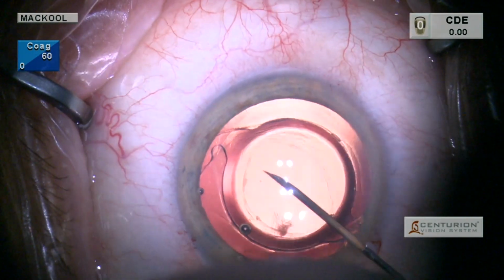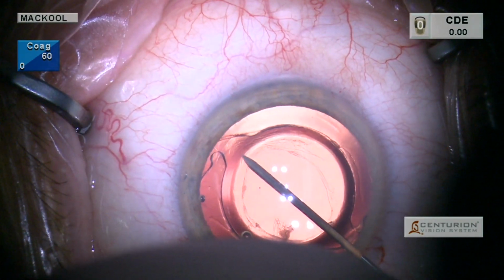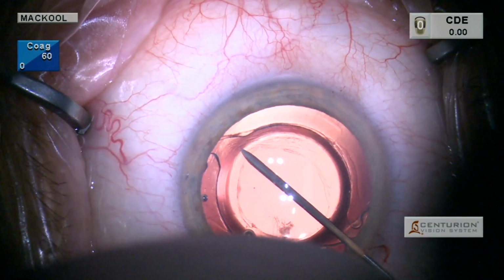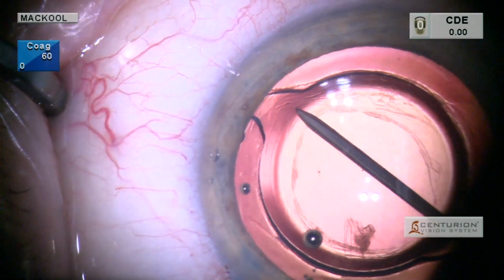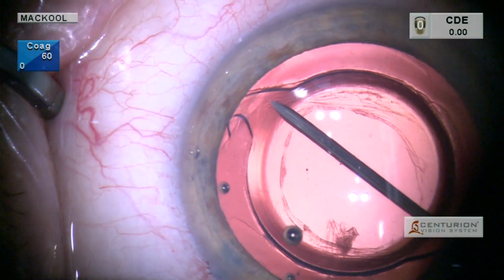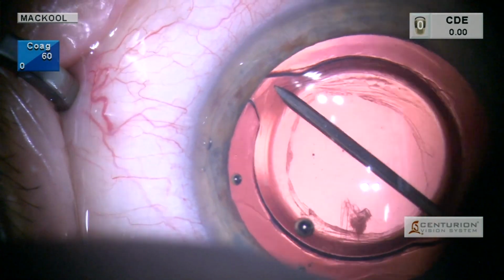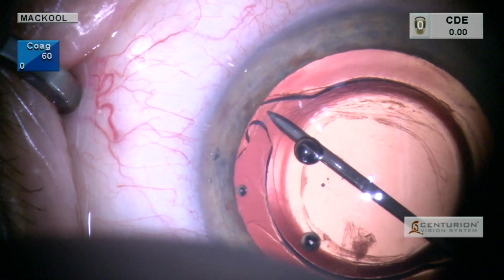And through this incision I'm going to insert a 30 gauge needle with visco attached to it and see if I can visco dissect the anterior capsule and free it from the IOL. And we want to do that, of course, over a haptic where the posterior capsule is protected. So I happen to be trying this now beveled down and sliding underneath.